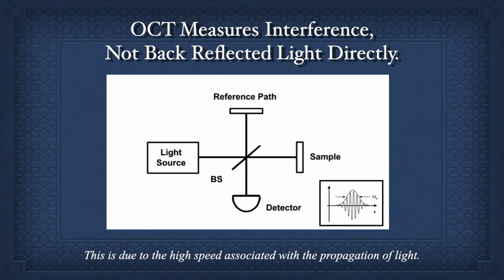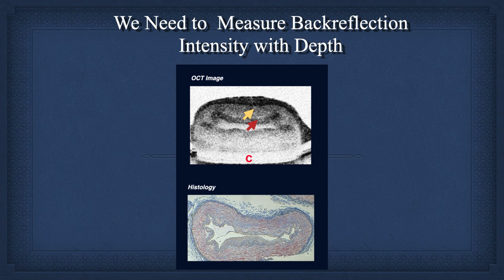So with ultrasound, we measure the distances. Let's go to the next slide first for a second. We want to make out the layers. We're imaging through a mesenteric artery, I think this is the celiac artery, straight through, and we want to make out the layers. With ultrasound, we would just measure back reflection intensity at different levels by the time of flight.